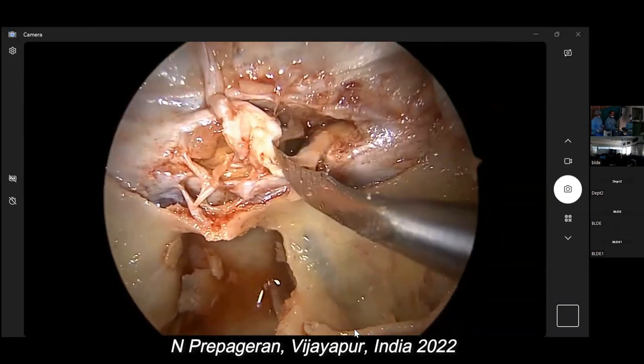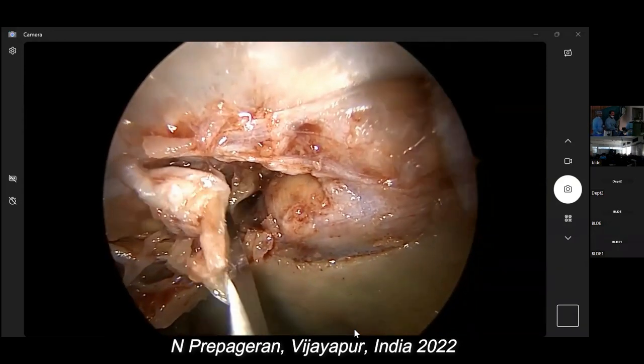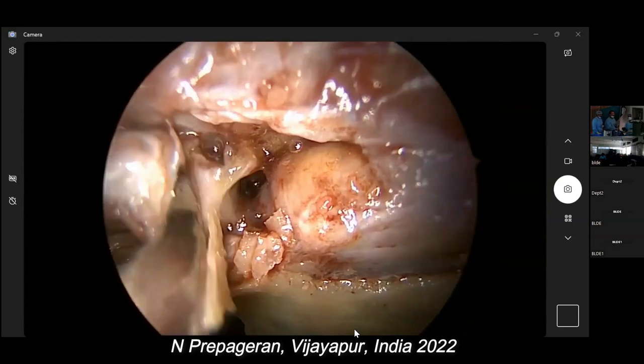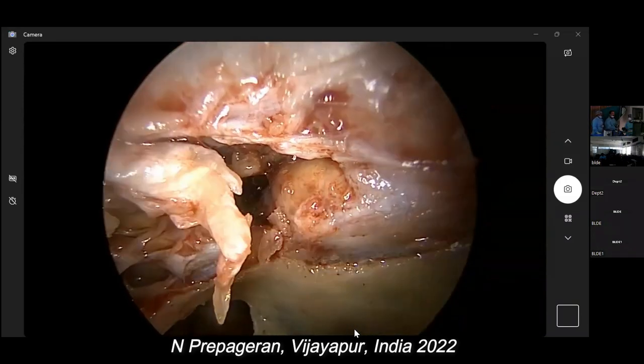So as I do this, that's a superior hypophyseal vessel. Beautiful. Can you see? Yes, very nice. This one there? This is the carotid artery there? Superior hypophyseal artery. Fine. Nice, right?